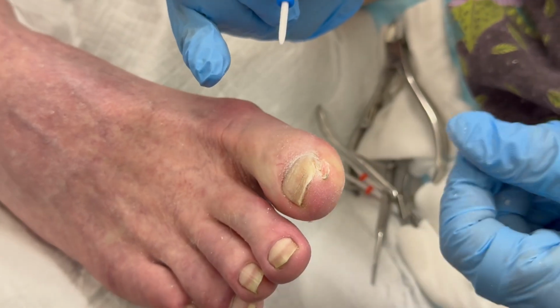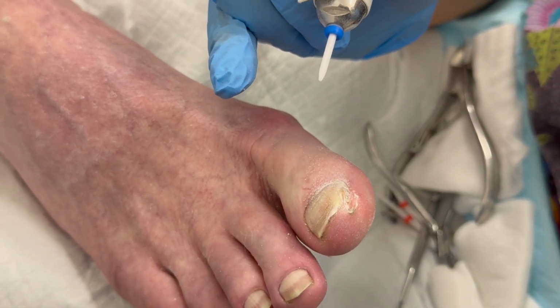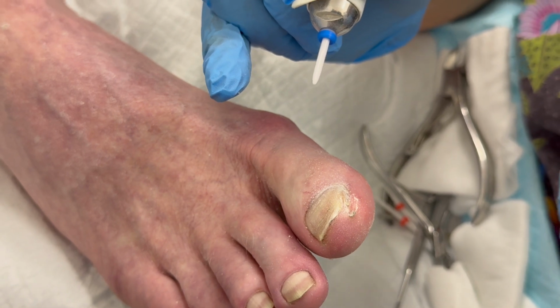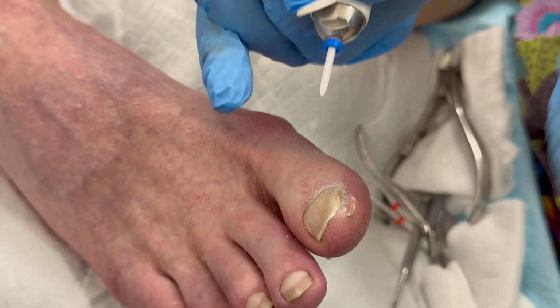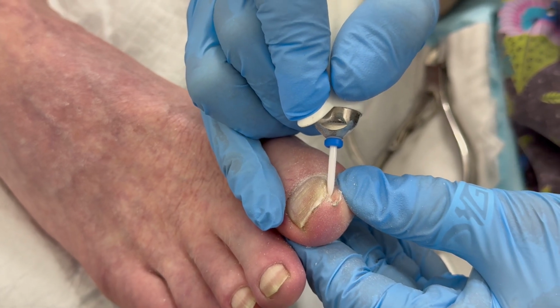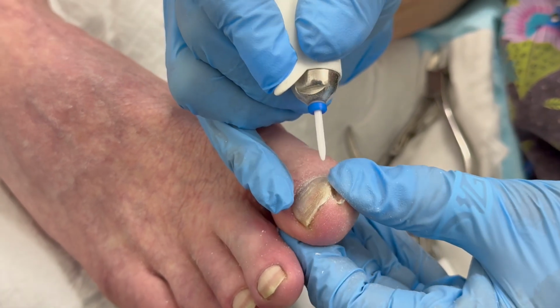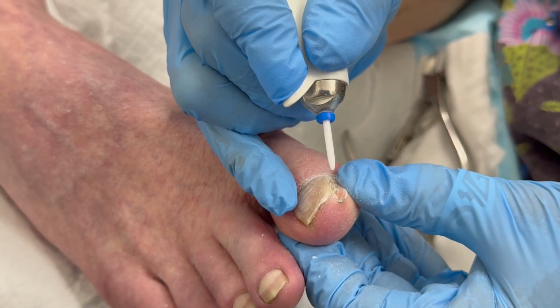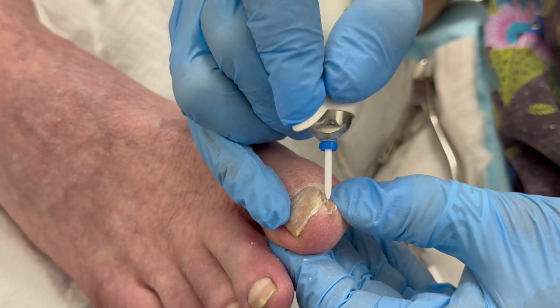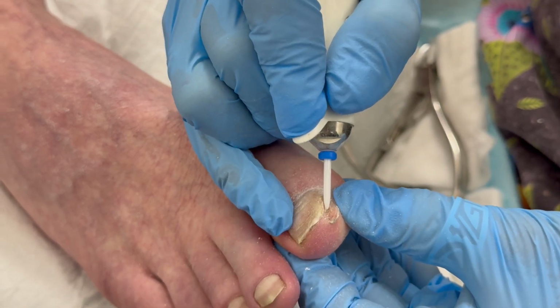So this is actually sort of a mechanical matrixectomy, which is what they do surgically, but what I'm doing is disintegrating the ingrowing nail, so it'll come back, unfortunately, but it'll buy him a long time. I mean, it's been a long time. A year? Six to eight months. Okay, anyway, so I'm happy here.